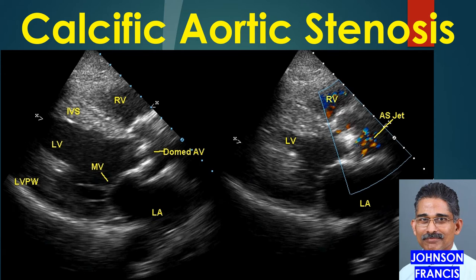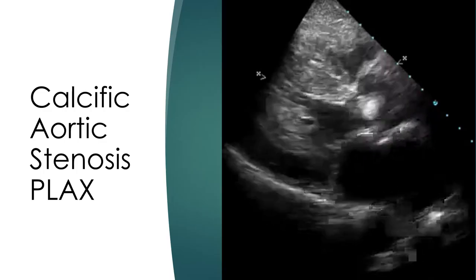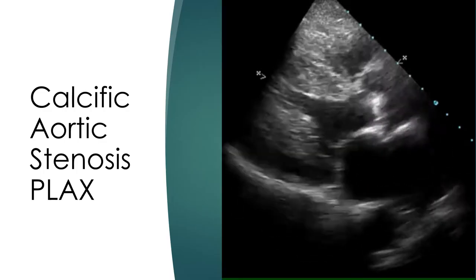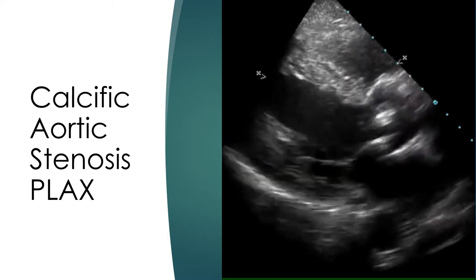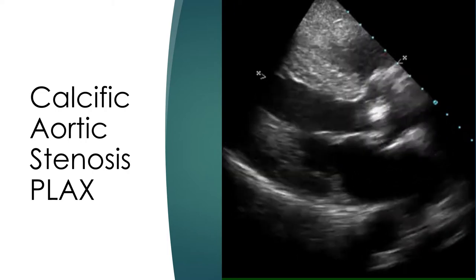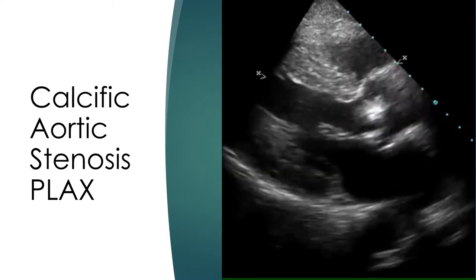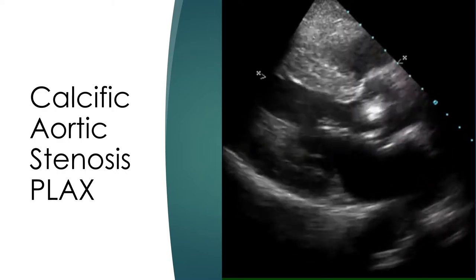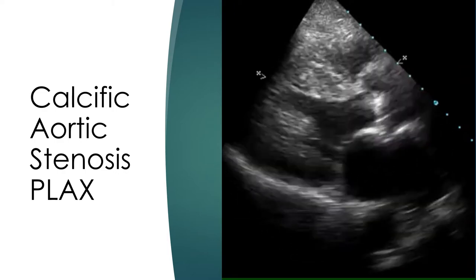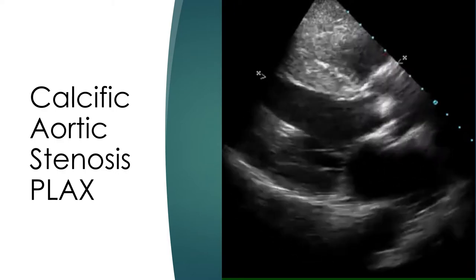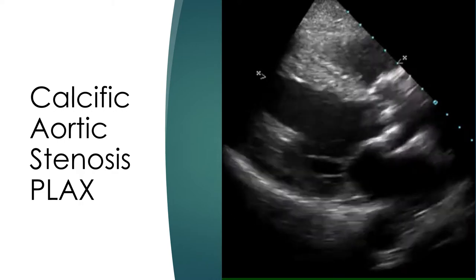Colored Doppler echocardiogram in calcific aortic stenosis. Echocardiogram in parasternal long axis view showing calcific aortic valve which domes in systole with restricted opening. The aortic orifice is quite narrow.